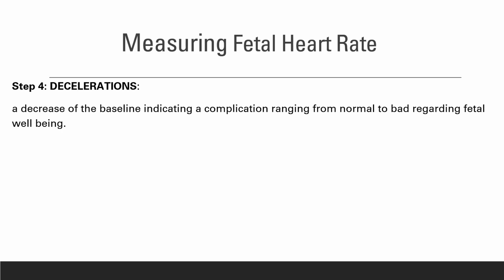And the second step is to measure variability. So variability is the fluctuation in the fetal heart rate baseline. Again, this is done in minutes as well as we're capturing the amplitude of the frequency. So basically, it's your beat-to-beat push and pull balance between the sympathetic and parasympathetic system. So it's basically your beat-to-beat heart rate for that actual fetal heart rate.